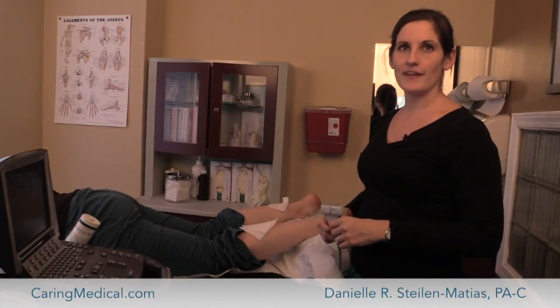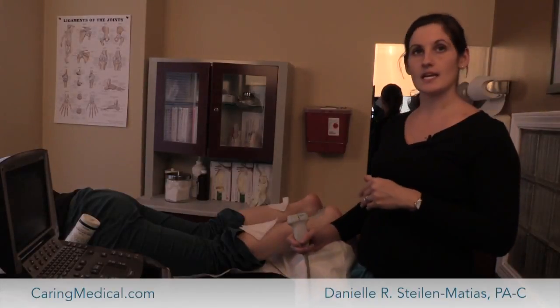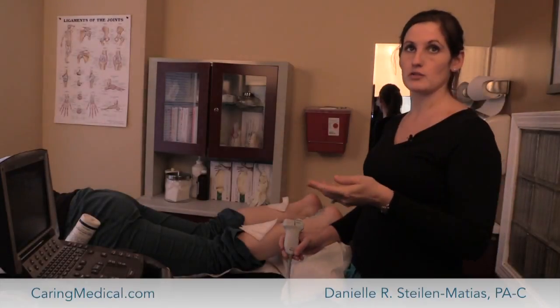Hi, I'm Danielle, one of the prolotherapists at Caring Medical and I'm going to talk to you a little bit today about Achilles tendon pain and how we use the ultrasound machine to help us with both diagnosis and treatment.